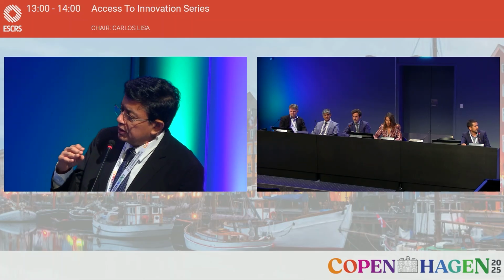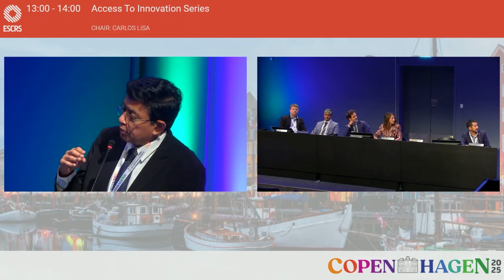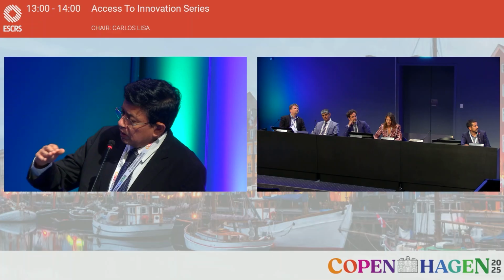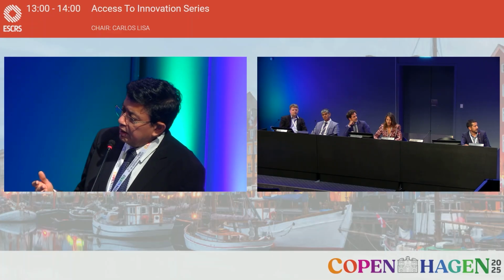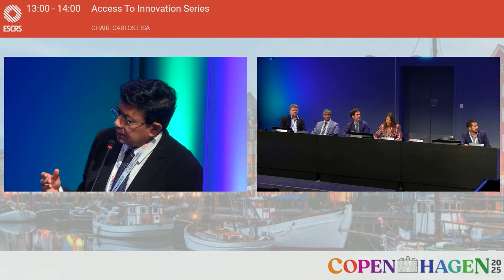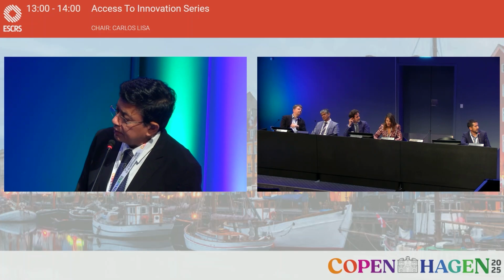And especially in the near vision, it tends to drop off from about 2 diopters of defocus, because of which beyond 50 centimeters, they seem to be quite inadequate. While in this case, it's almost up to 2.8 diopters, a fairly flat curve. And once binocularly implanted, you find that it's even better. It's almost 3.2 diopters. And that's the reason that this lens seems to be a little better compared to the other currently available lenses, like the Galaxy, the POC. Compared to that, there's some amount of near vision capability that comes in without a compromise as far as the quality of vision is concerned.